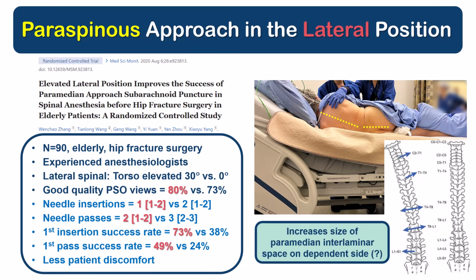Since reading this paper, I've had the chance to try it out once myself in a hip fracture patient. I elevated the head of the bed as shown, and I made no attempt to forward flex their lumbar spine or legs so as to improve patient comfort. The spinal was very easy to perform, and so I have to say that it does look like a promising strategy, and it's one that I will probably keep experimenting with.